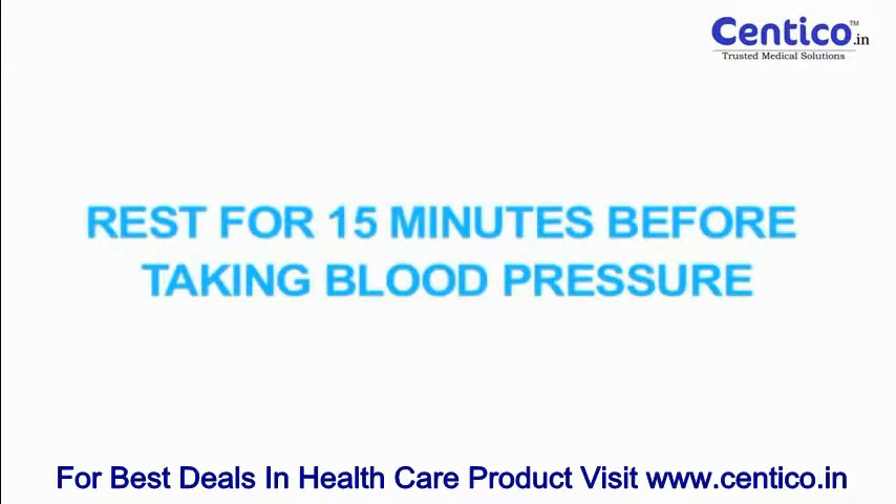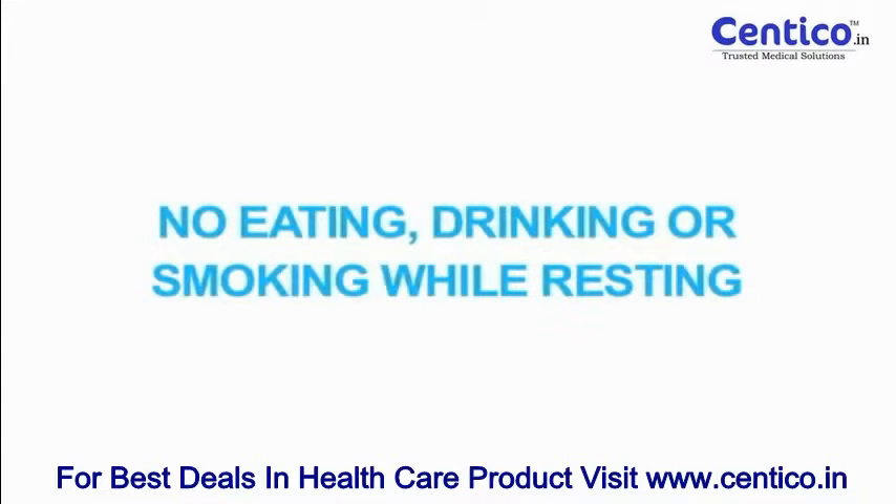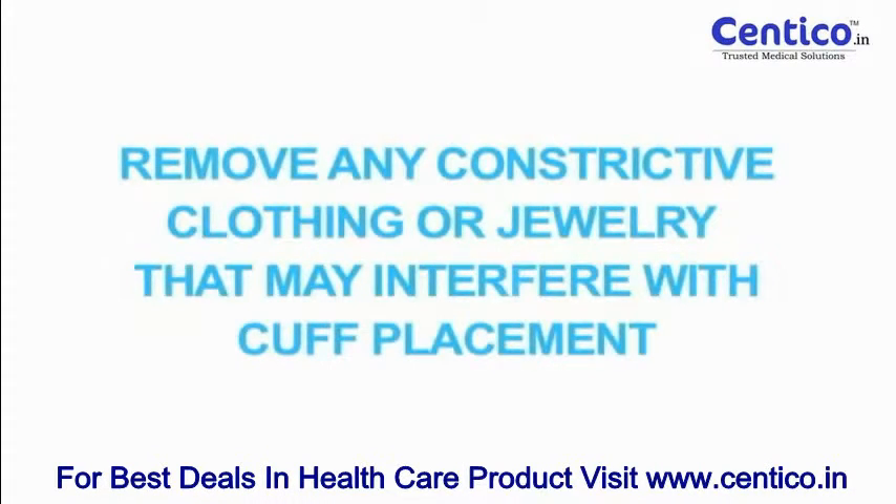Before taking your blood pressure, a 15-minute resting period is needed to stabilize the body prior to taking a reading. No eating, drinking, or smoking while resting. Remove any constrictive clothing or jewelry that may interfere with cuff placement.